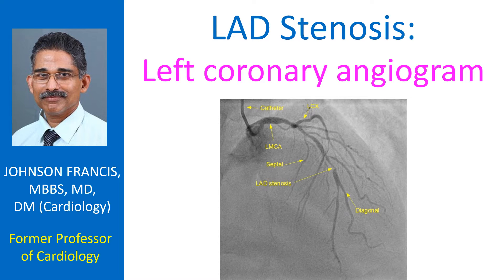Left coronary angiogram showing tight stenosis of distal left anterior descending coronary artery, just prior to its bifurcation into a terminal diagonal. There is mild stenosis of the parent LAD in both distal and proximal regions. Multiple septal and diagonal branches are seen originating from the LAD, which appears to be a type II vessel reaching up to the apex, though the distal most part is not very clear in this image.